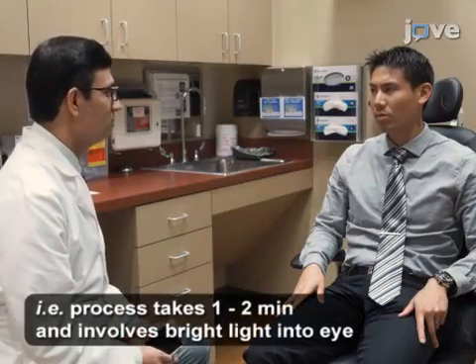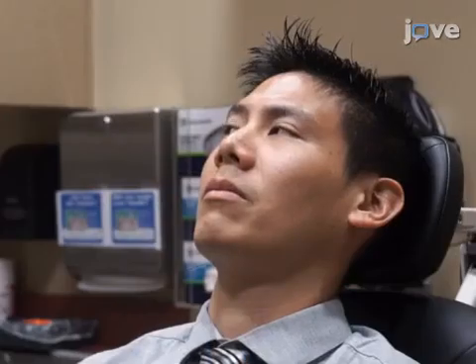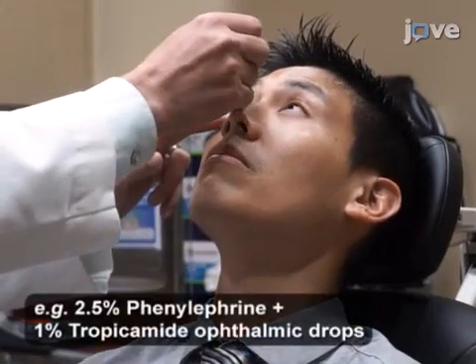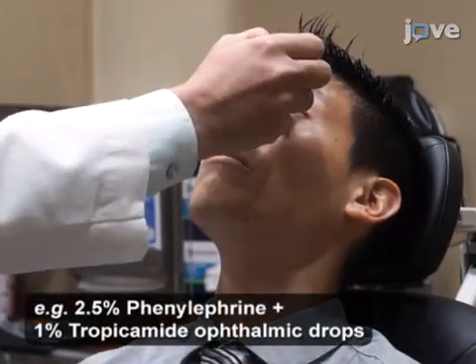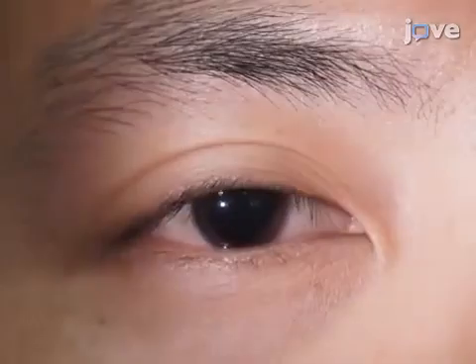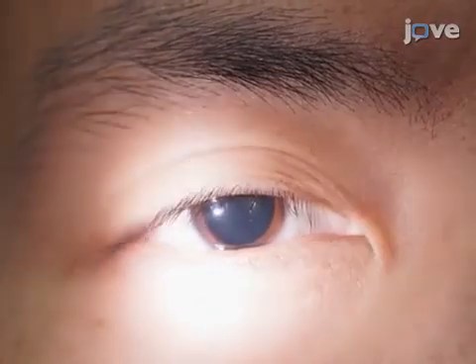Before beginning the imaging, explain the procedure to the patient. After obtaining permission, deliver 2 different mydriatic drops 2 to 3 minutes apart to the eye that will be examined. Wait 15 to 20 minutes for the pupil to dilate.